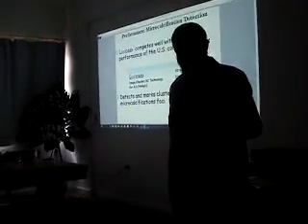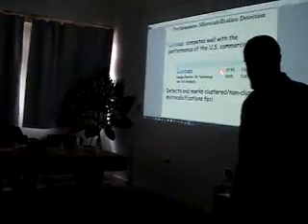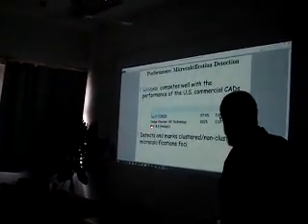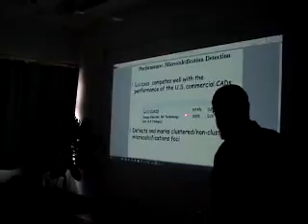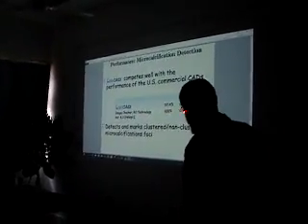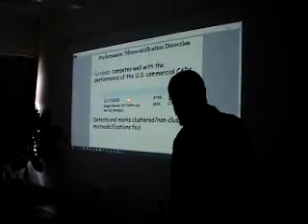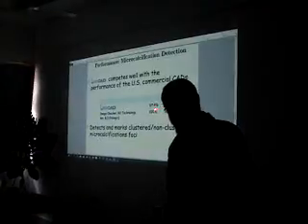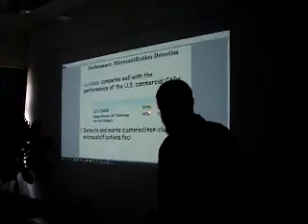For the accuracy, for example, this is a commercial product, Image Checker and Hologic in the US. Image Checker produces 100% at 0.13 false positive. We produce 97% at 0.5. They are better, but however we are very close.